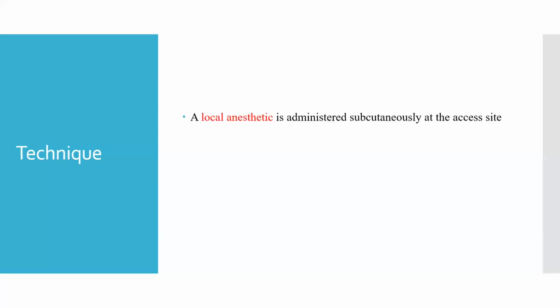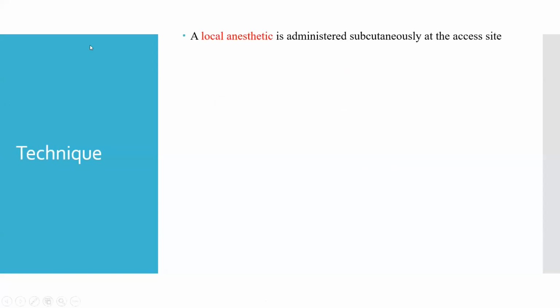So step by step for the technique. First, a local anesthetic is given subcutaneously at the access site.